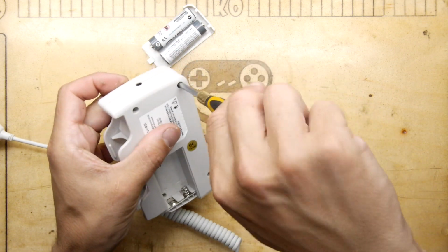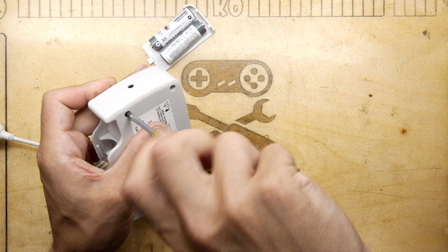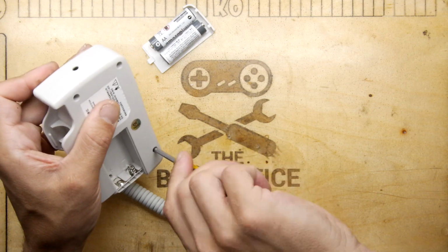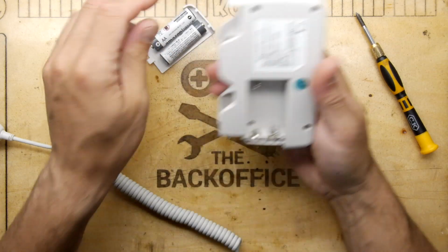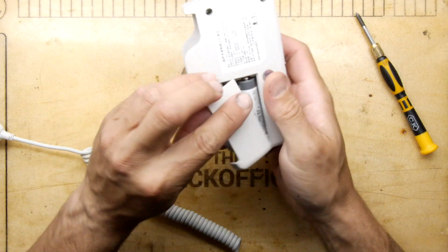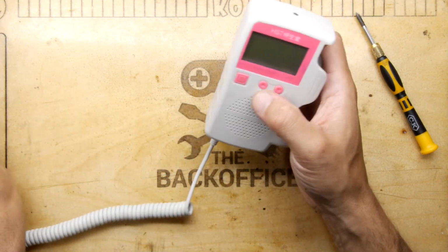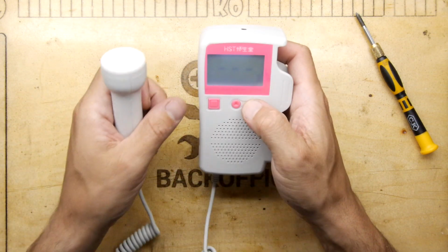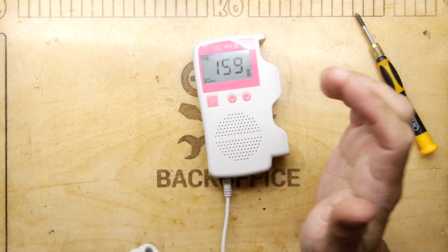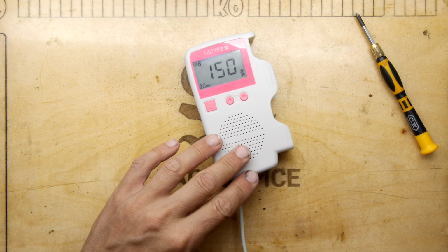Something I haven't tried yet is at the top you can see there's a headphone output too, so if you did want to record what you find, you could easily hook that up to your PC and have a record, and possibly you could do some analysis with it by using these straight into a PC, and you could use some audio processing software to see what you can hear. Now I did have a play with this touching it on different things, and I'll show you now. It's not like hello. So you think it could be like a microphone, but not really.